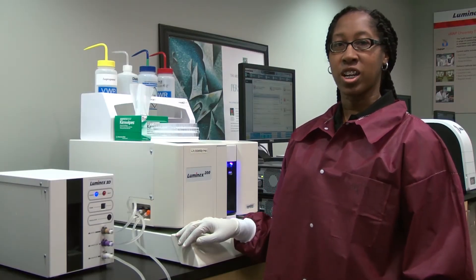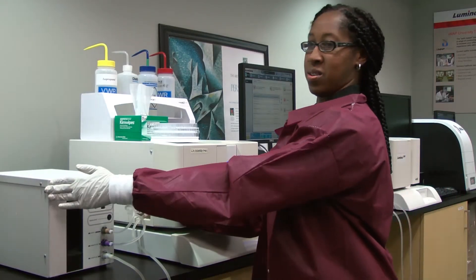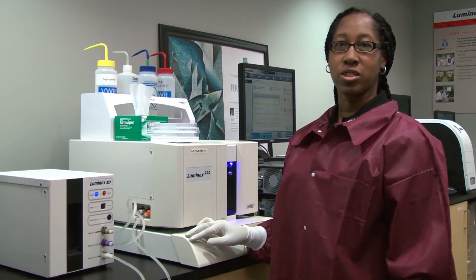This is a quick tip on how to change the SDS unit to the sheath bottles on the Luminex 200 instrument.